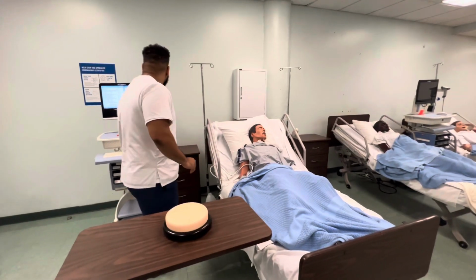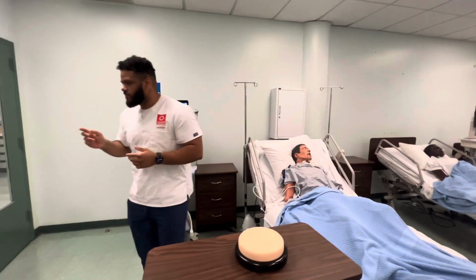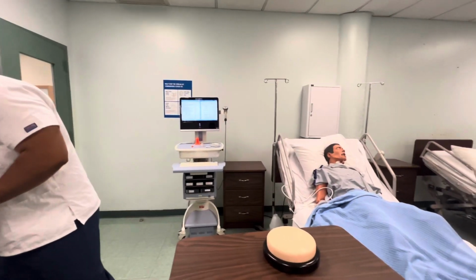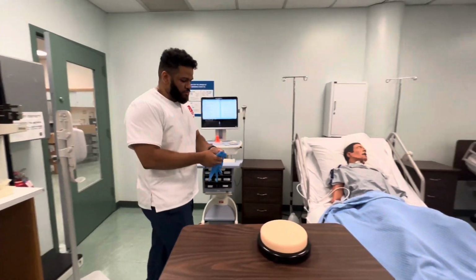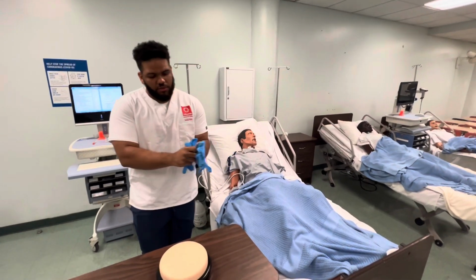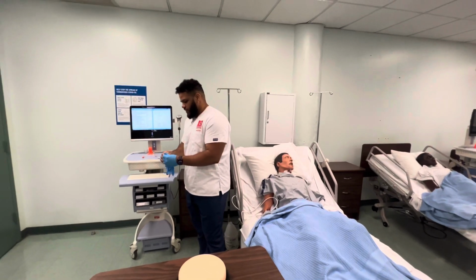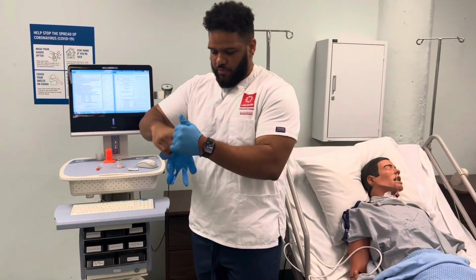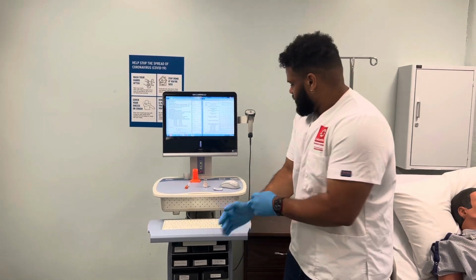So made them part of it, and we're going to simulate that here. So from here, you perform hand hygiene, put on your gloves. Now that you have your insulin already prepped, from here it is just a matter of executing the injection.